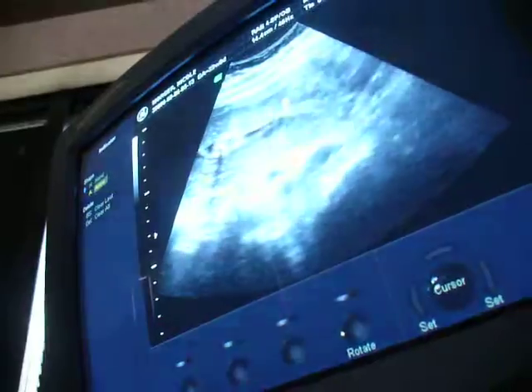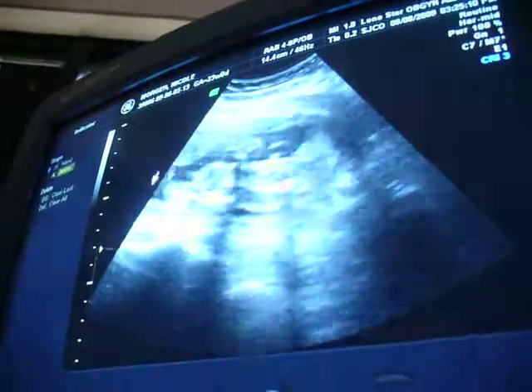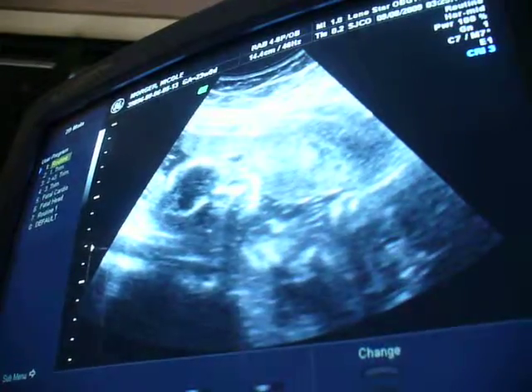Side. Here's the other foot right there. Yeah, but it's definitely a little girl. We've got the little labia right here. Little girl. I'm going to let you go over to the doctor's office, okay?